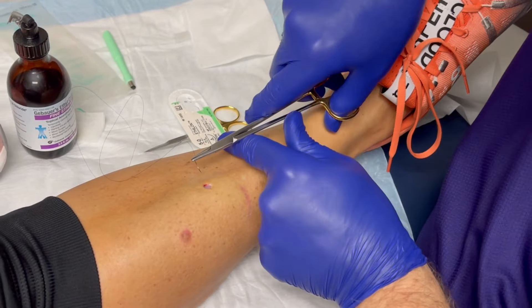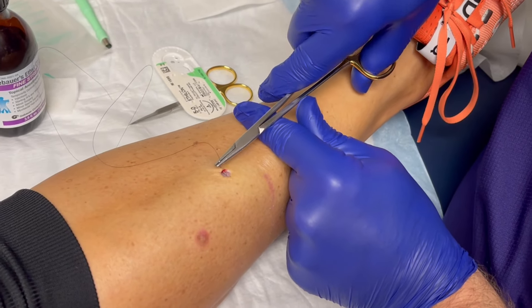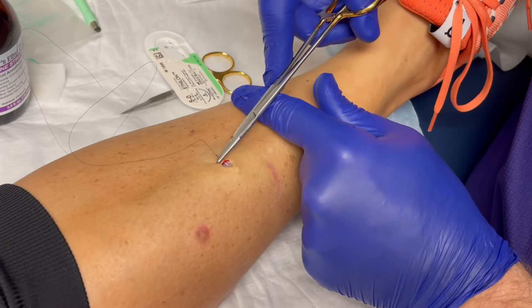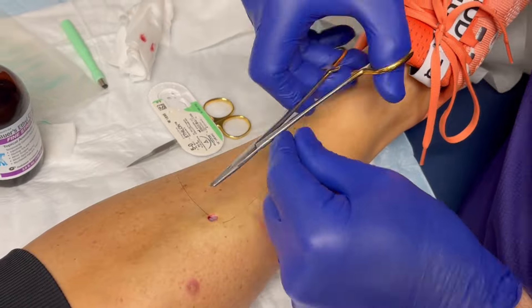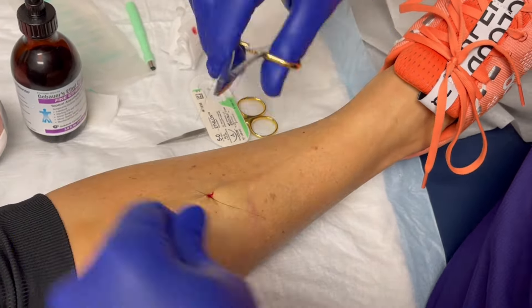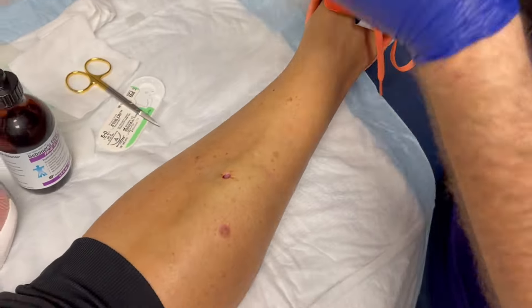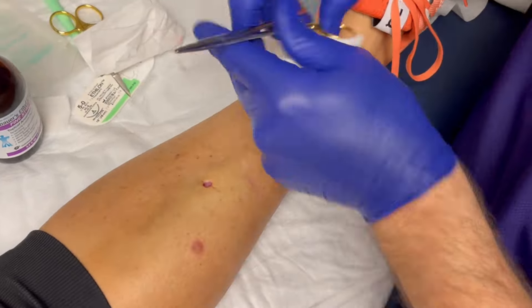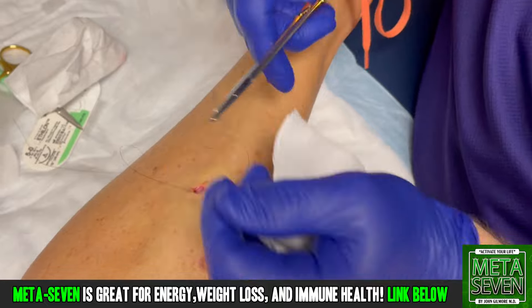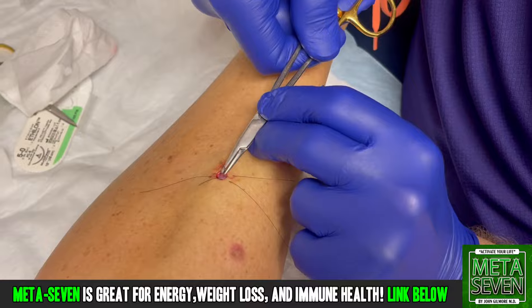Just one stitch is all it's gonna need. Gigi, this stitch needs to stay in for just five days. You can remove it yourself with some nail clippers, or come back in and we'll remove it — whatever you want to do is fine. After that, keep it covered for a few more days.